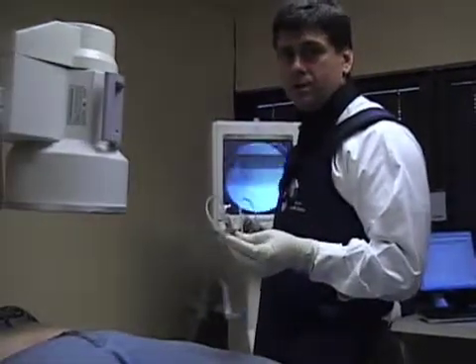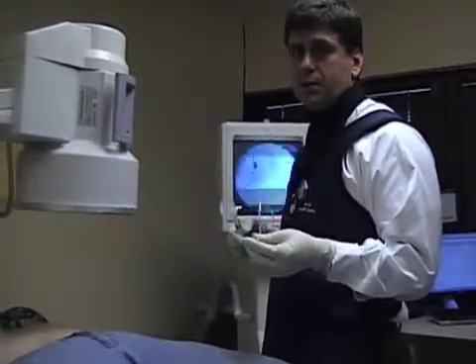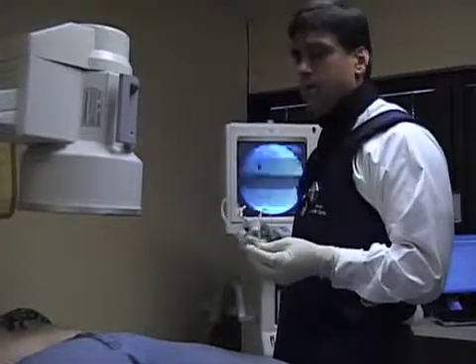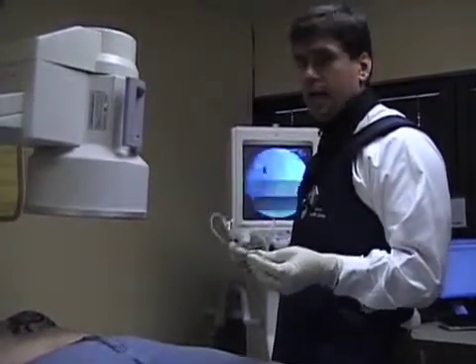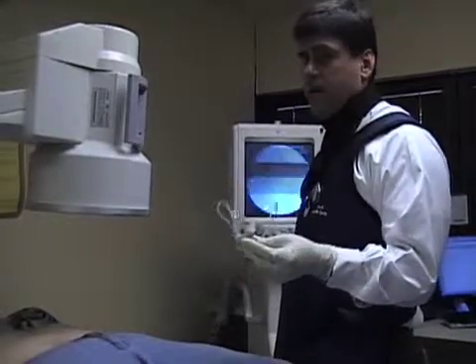Hi, I'm Dr. Beperier, and me and my partner, Dr. Cedar, are part of the Bariatric Medical Institute of Texas. I'm going to give you an example of what an adjustable gastric banding fill is like. This is very candid, it's unedited, and it's in real time.